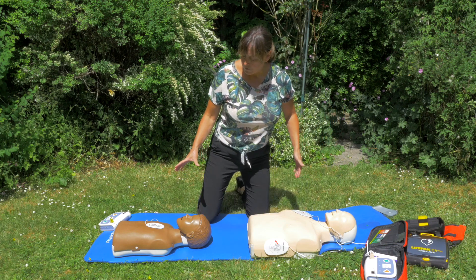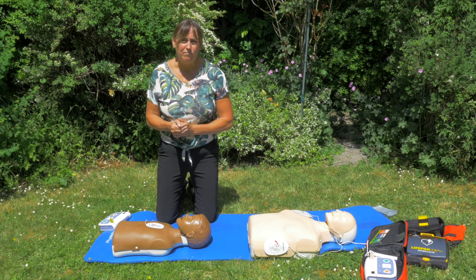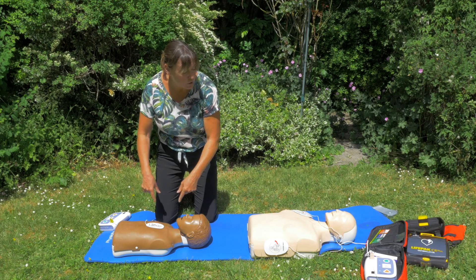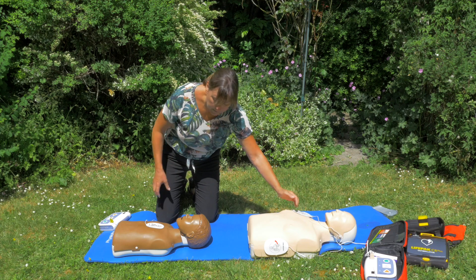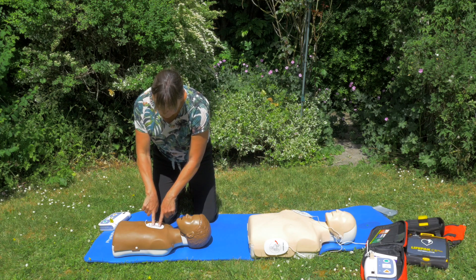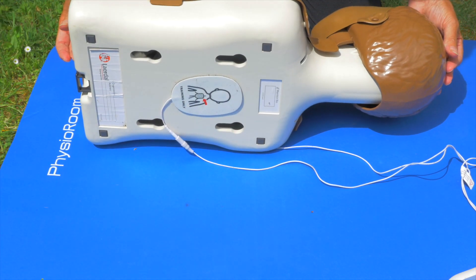You may have a child — the definition of a child is one to puberty, so that's roughly 10 for a girl and 12 for a boy. Their chest cavities are too small to put both pads on the front, because the shock needs to go across the chest and back again. So for a child, or even a very small adult, we would apply one pad on the front in the centre of the chest and one on the back in the centre of the chest.